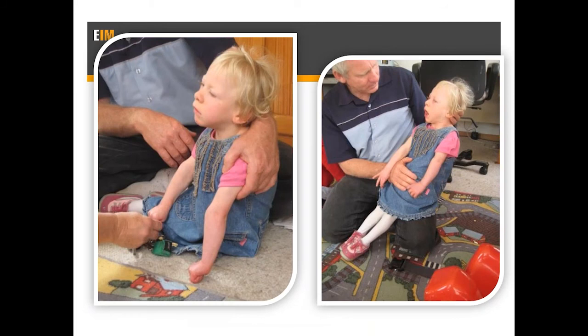Here we have motor control and a spasticity abnormal reflex as our main issue. When she gets triggered, we get lots of extensor overflow. So we'll have lots of pressure, lots of shearing forces, and no stability and no control of those body segments for function. And then here, if we get her into a little bit different posture, now we are much quieter, and we have low trunk control, low head control. So can we find a posture that will allow her to start better controlling her body segments, and spend less time triggering into a real extensor response?